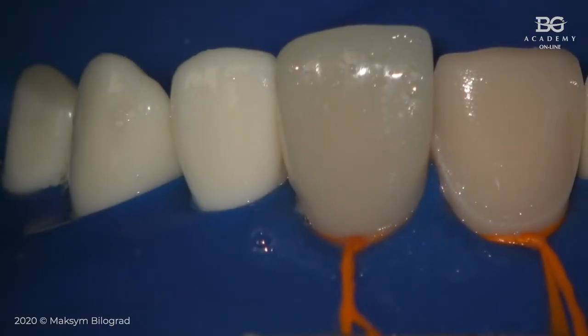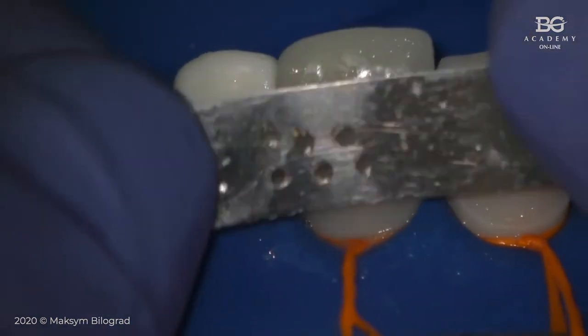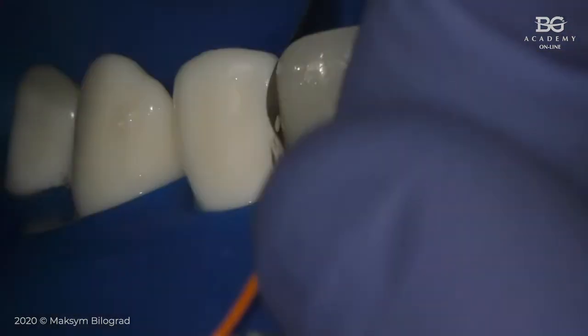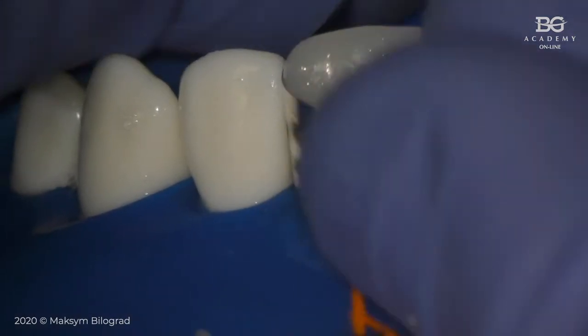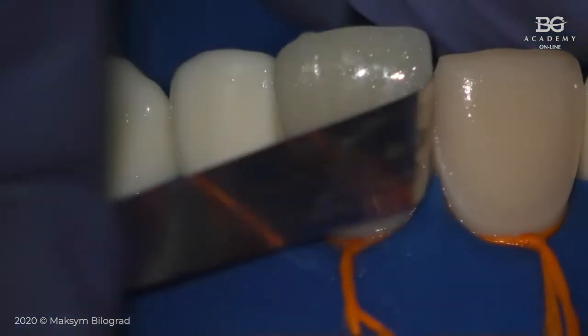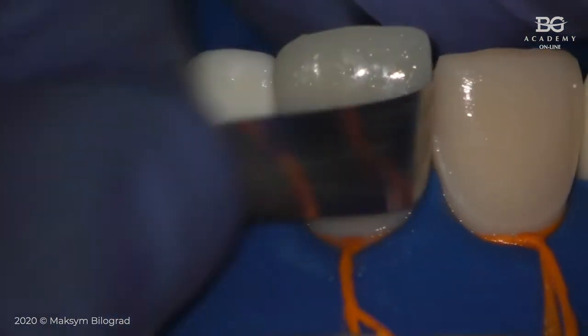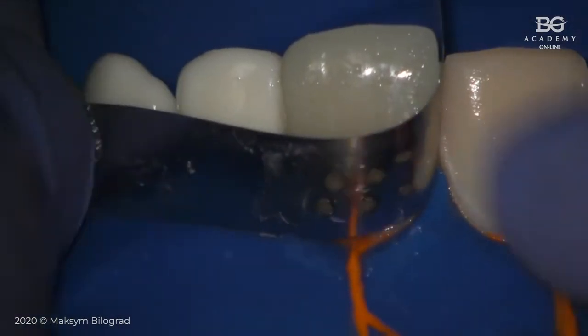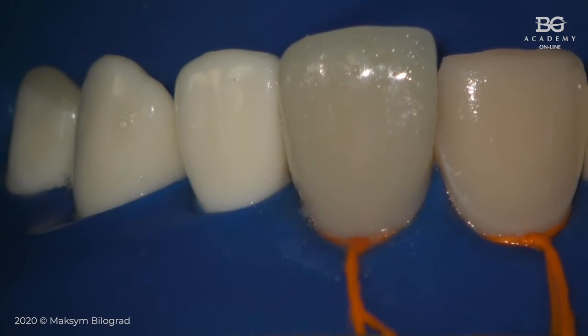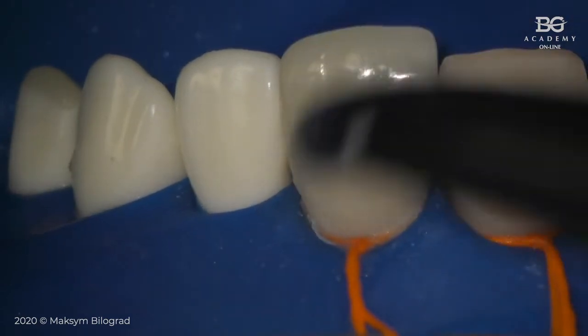If you use floss before you light cure, there will be no problem. But if you do have a problem, you can take a metal strip perforated like a saw, and go with it between teeth like this. This is a non-abrasive metal strip, just perforated, and when you move this strip forward and backward, you may get some cement inside these perforations, and in this case you keep your interproximal contact and you are not making the ceramic rough.